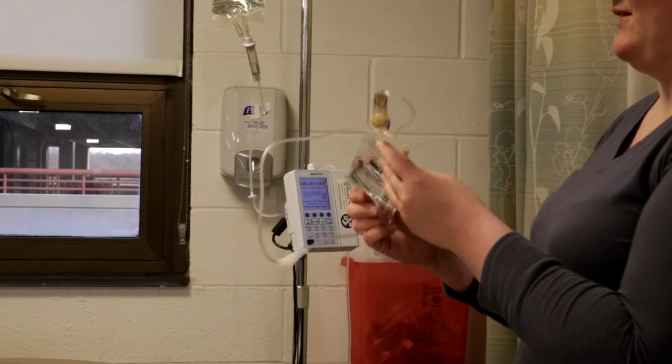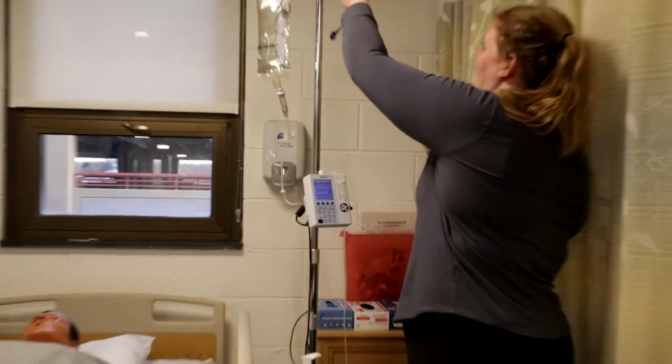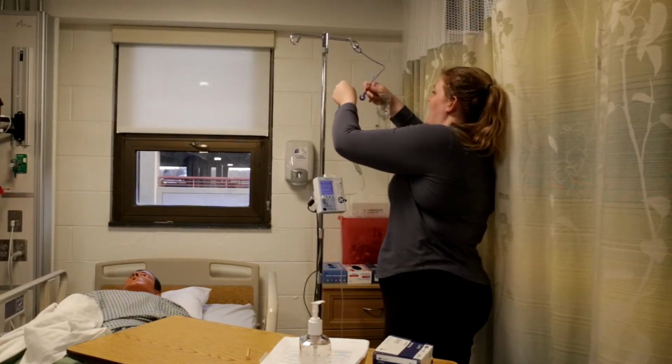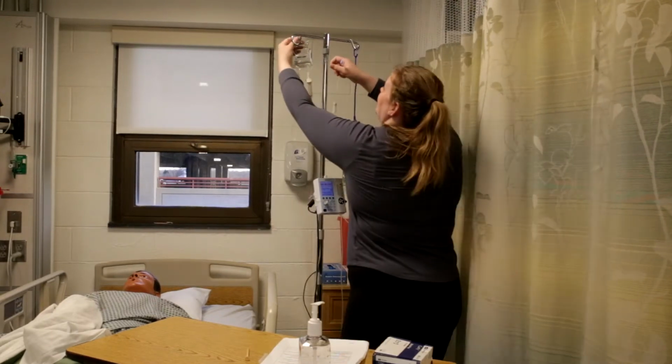Okay. And then I'm going to take this and I'm going to hang it up here. And I'm going to take these fluids and hang them on here. Okay, and then take this one and hang it up here.